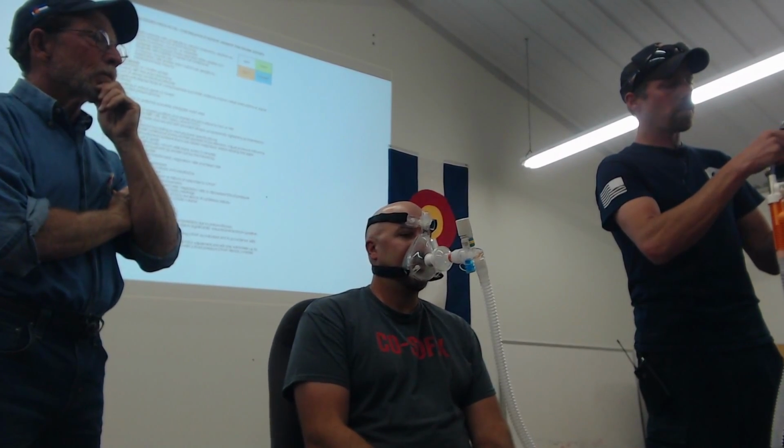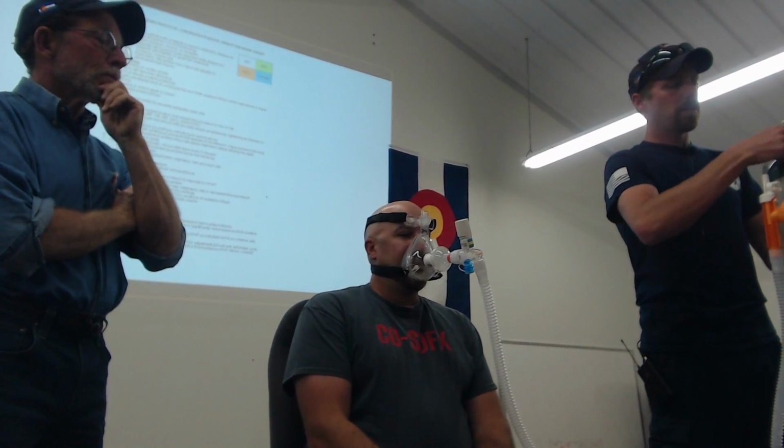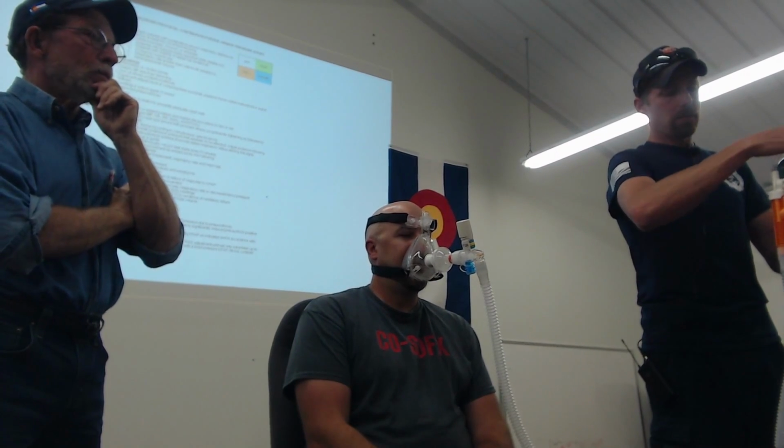Well, it's not the full pressure of the bottle. I mean, we're at 2,000 PSI in here. It's still a regulated pressure, but it's a much higher pressure than this is. So as soon as you screw this on and it's down tight, it's going to press that. And so you can hear, I mean, it's definitely got some sound.